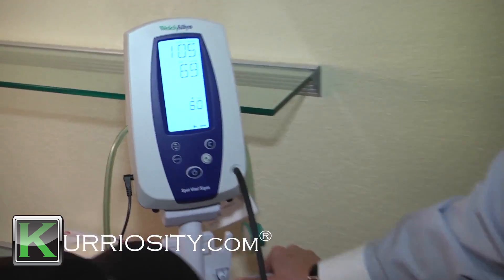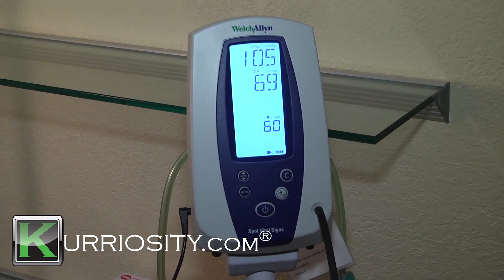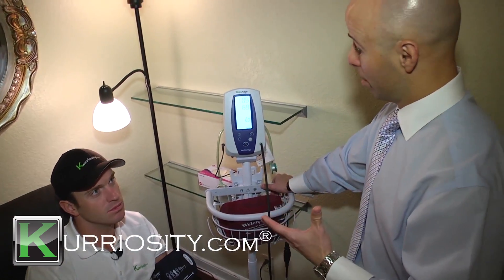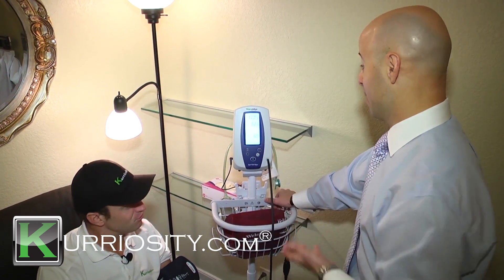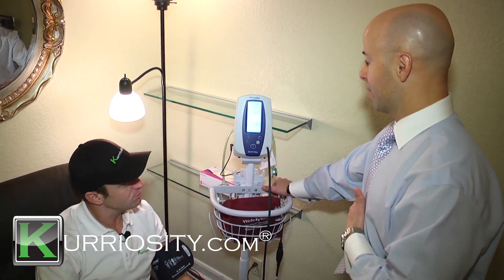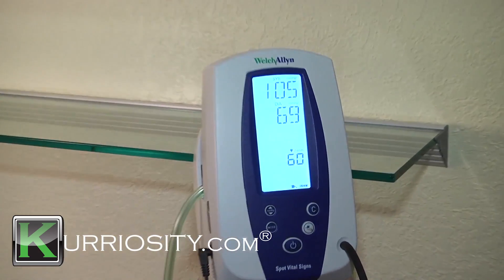We get 105 over 69. That's solid — even I know that's solid. Yeah, that's good. Everybody shoots for 120 over 80, and a little bit below that is better. A pulse of 60 indicates that you're athletic and you work out and take care of yourself. So this is actually very good and healthy blood pressure. Is that my heart rate? That is your heart rate — 60 beats per minute. That's very good.